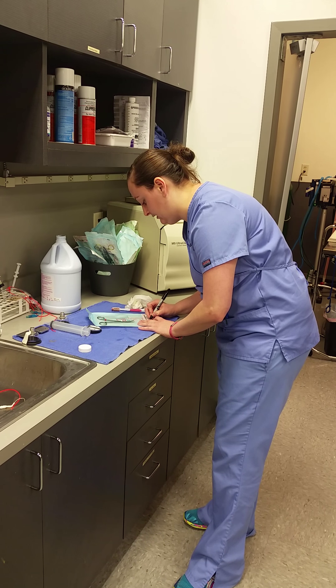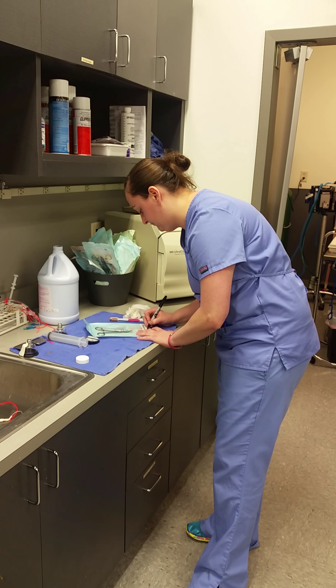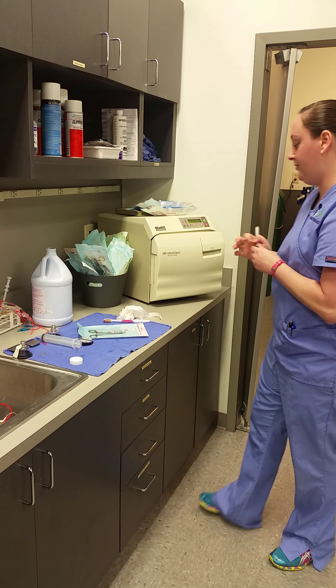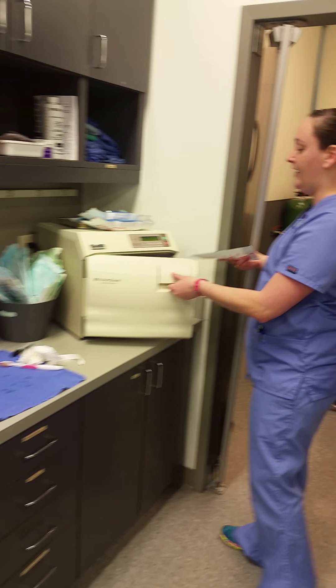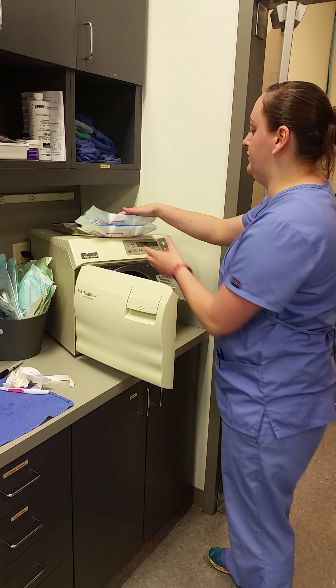And today is the 21st. So then operating the autoclave, you'll put the instrument or the pack on the tray — I'm actually going to do these too, these are just towels.